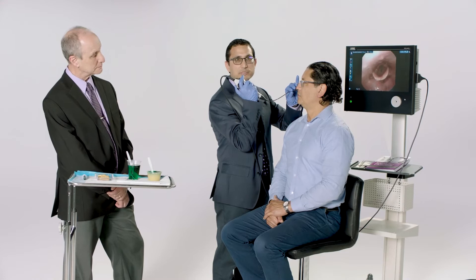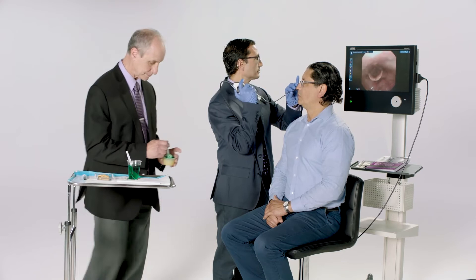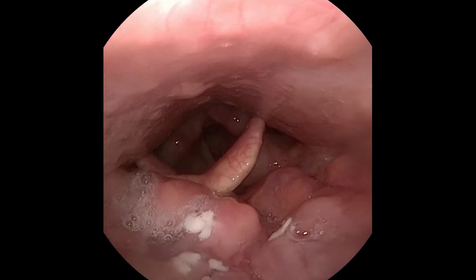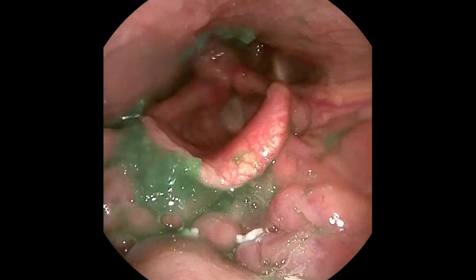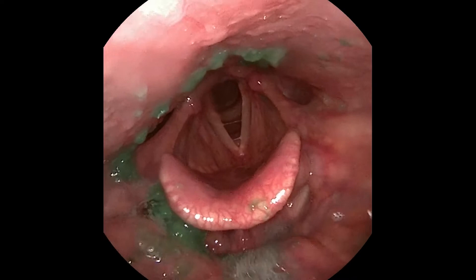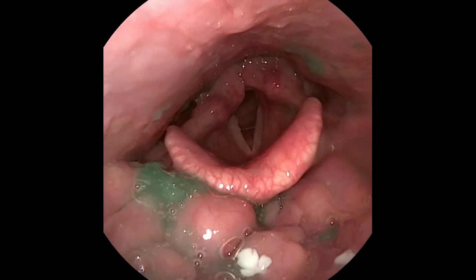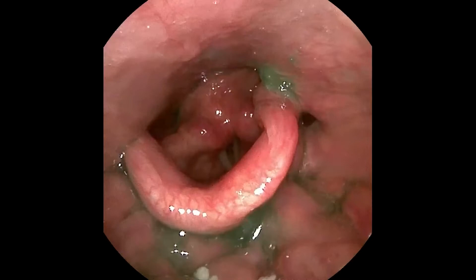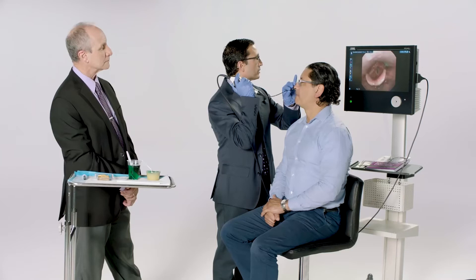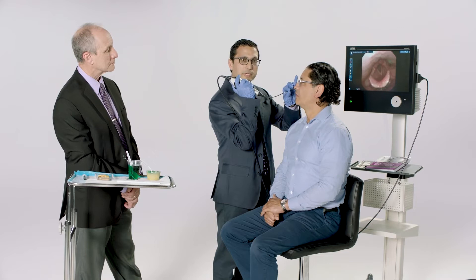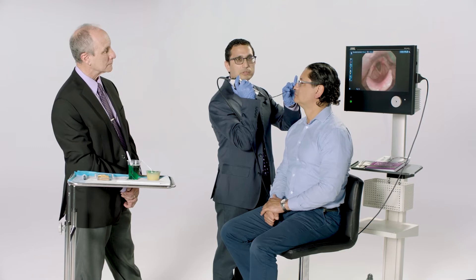Starting with the pureed food consistency. While Andy's feeding the patient, I'm looking at what the food bolus is doing as it goes down. We want to test the same bolus at least twice to check for repeatability. During the swallow, there is a white-out where you cannot see what is happening. After the swallow, you can observe for residue in the vallecula, posterior pharyngeal wall, and piriform sinus. After observing for residue, insert the endoscope further towards the endolarynx, looking for penetration and aspiration.